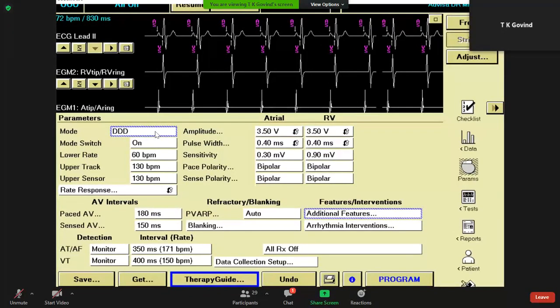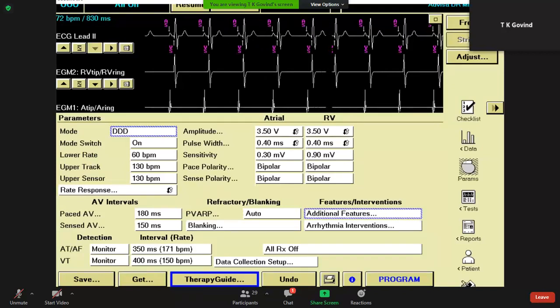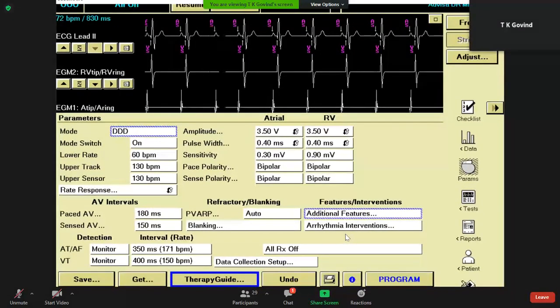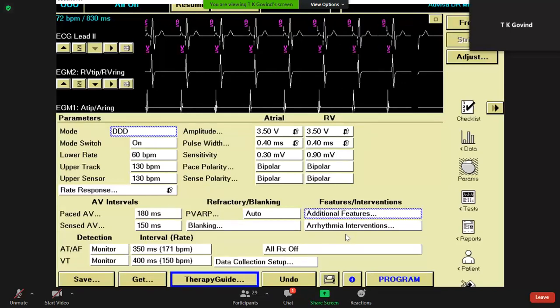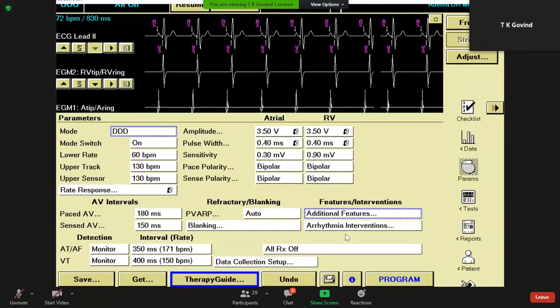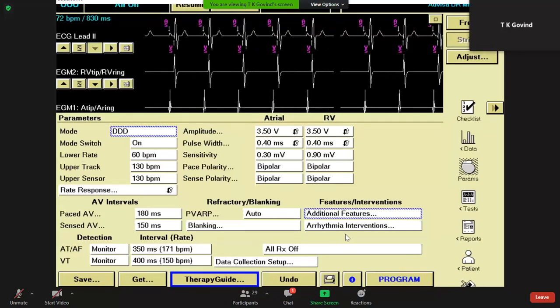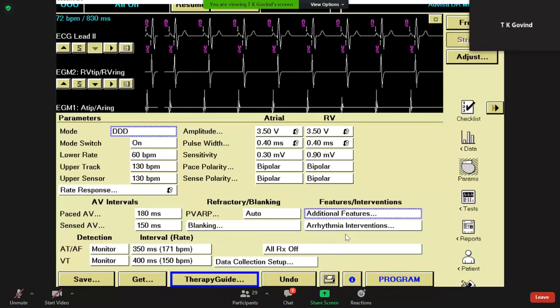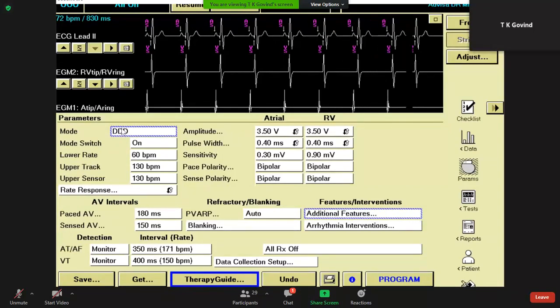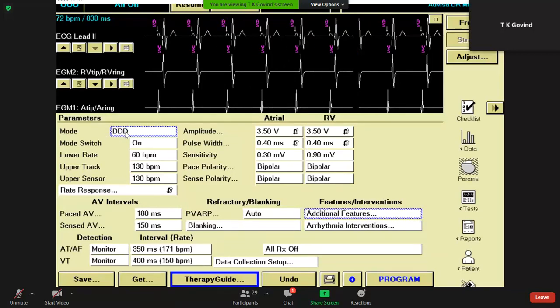Of course, if you know that this patient has an intermittent chronotropic incompetence, then it may be worthwhile considering programming the rate response. Also remember, the rate response of the pacemaker essentially comes from mechanical movement of the patient, and if the patient has any other reason for increased metabolic need, like fever, anger or excitement, then the conventional accelerometer based pacemaker may not increase the rate appropriately. So it may be good to leverage the patient's normal sinus node function. So for this patient, programming a DDD mode may be appropriate.